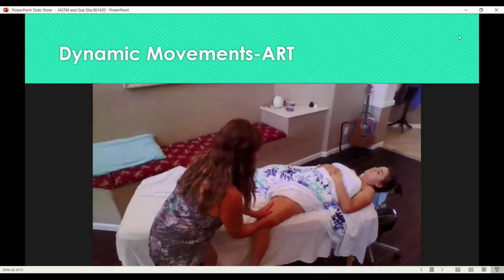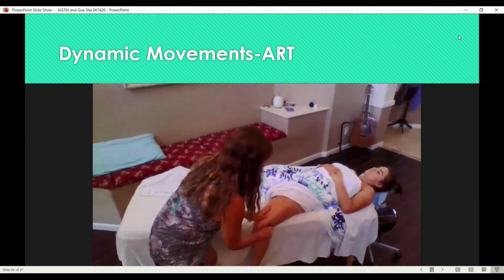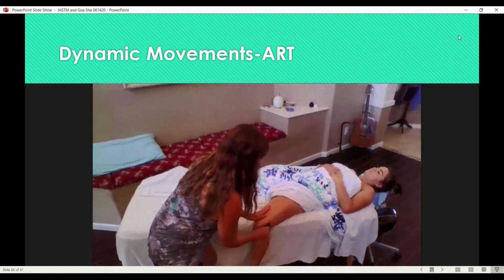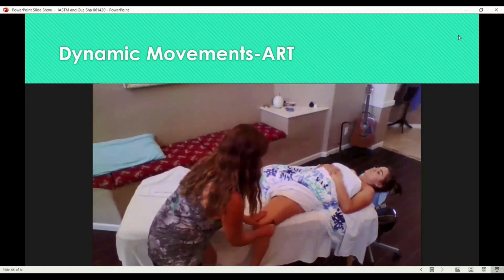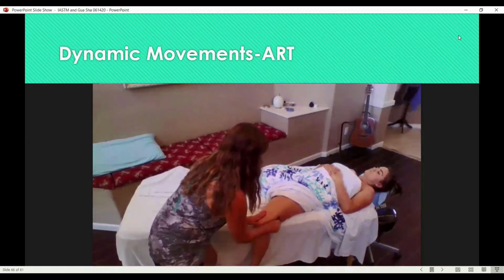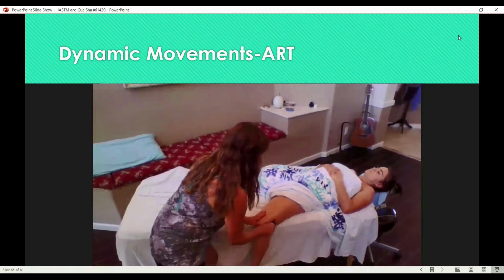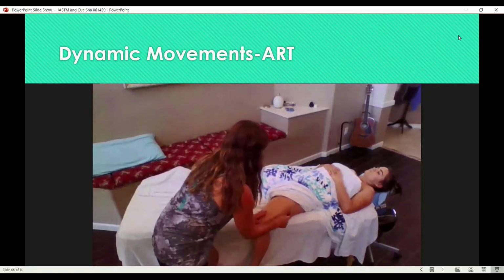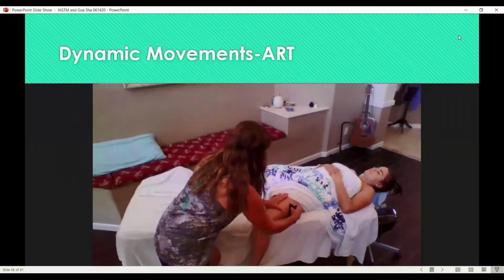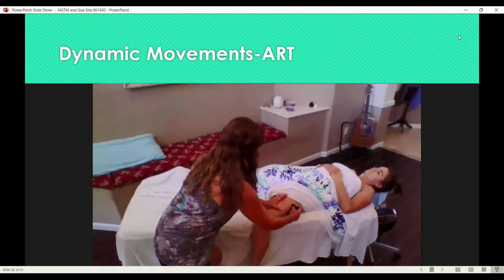Oh, here I'm doing some J stroke in the IT band, but in a different position. Or I can use the edge of the tool here. The gua sha tool is pretty nice. It's got a little cutout so I can go above and below the IT band all at once. Blending in the TFL.